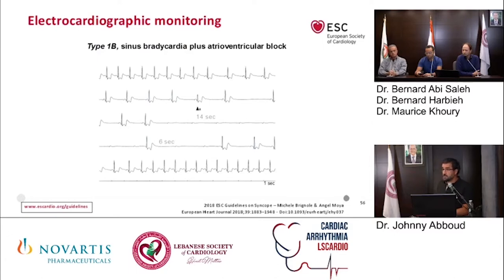So this is a significant pause and significant AV block, high degree AV block. But if you look here, it is debatable whether the cause is secondary to AV block or secondary to vasovagal syncope, of course.